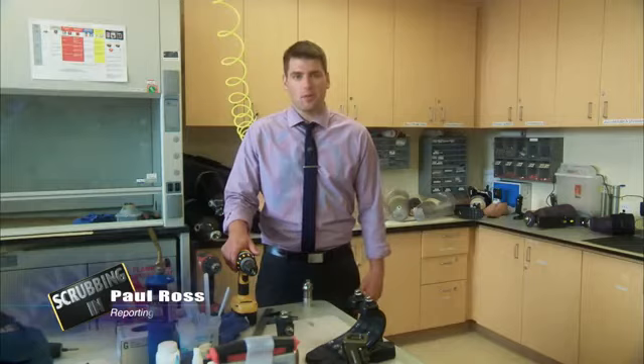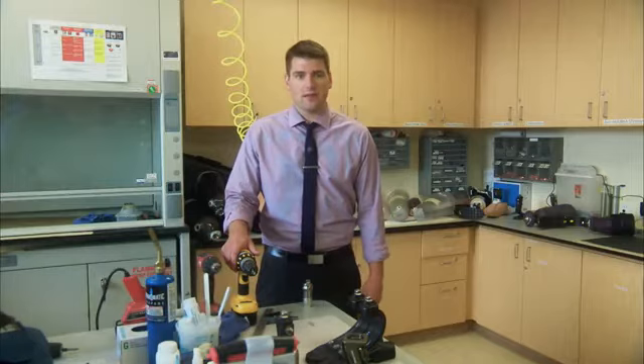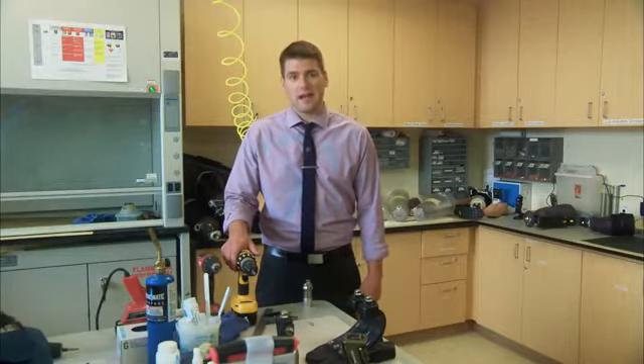Welcome to Scrubbing In. I'm Paul Ross. I'm going to take you around Navy Medicine to show who we are and what we do. We're at the Prosthetics Lab at Naval Medical Center San Diego. And while this might look like a machine shop, it's actually a place of healing. Let's see how they do it.